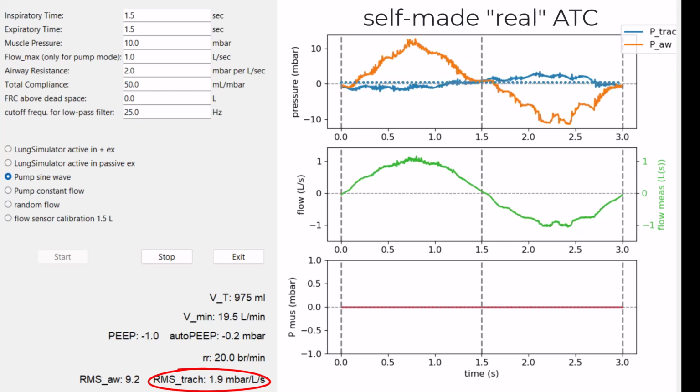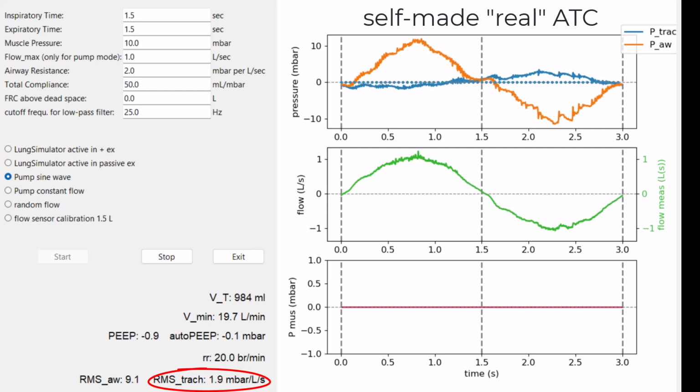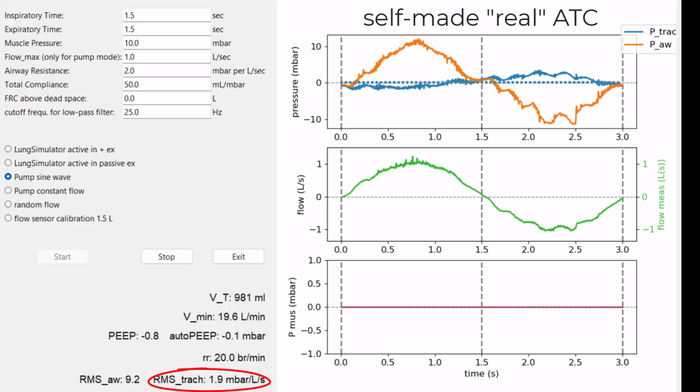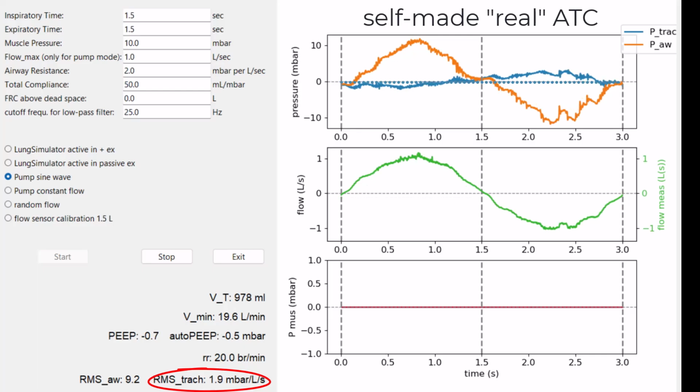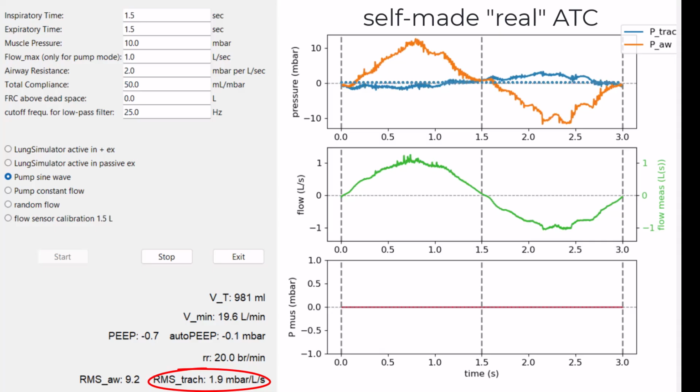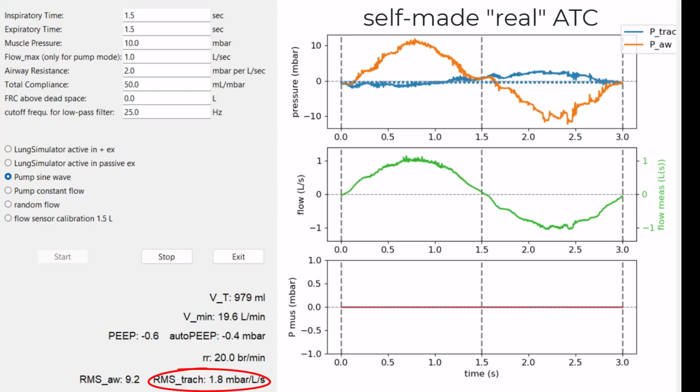Now compare this to my 3D printed self-made ATC ventilator. This is how ATC should really look like. A nearly constant tracheal pressure and a negligible added resistance of less than 2 millibar per liter and second. If you're not convinced by these measurements, do yourself a favor and breathe through a 7mm endotracheal tube connected to a commercial ventilator. Believe me, you will not tolerate this for very long, and neither will your patients.